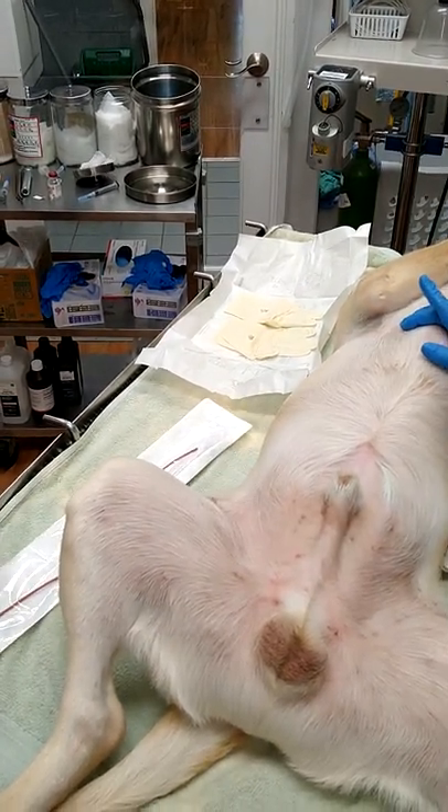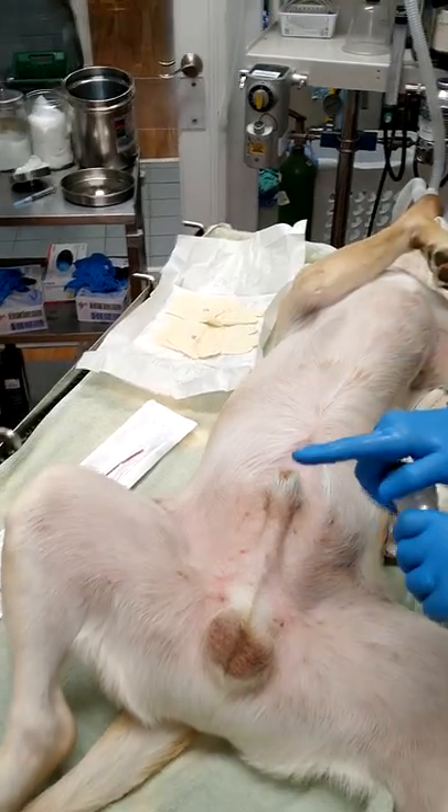A little more, just so you can grab it. Perfect. Just close it back on itself, and that way you can stick your finger right in.